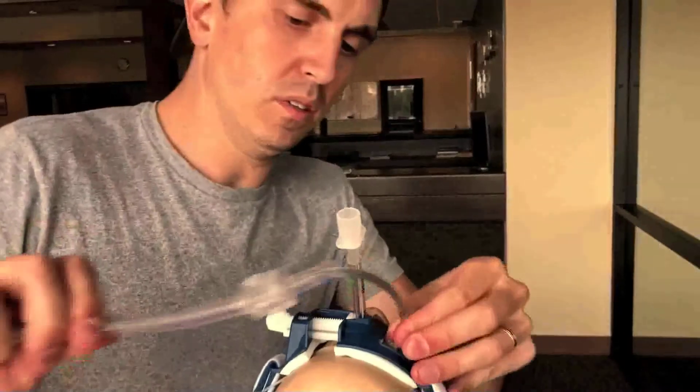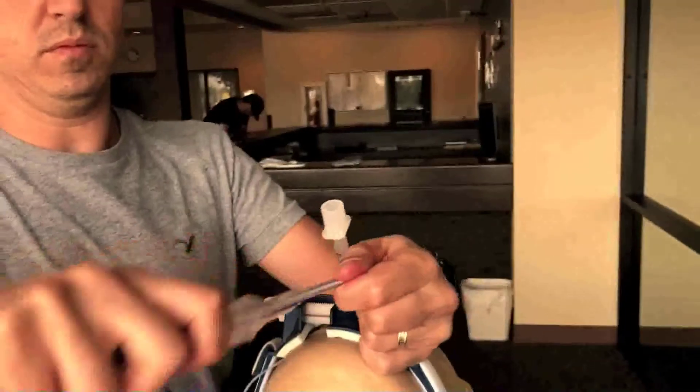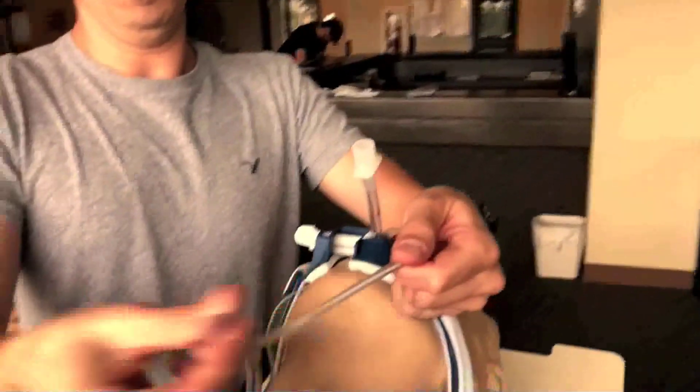We're going to slowly pull off the endotracheal tube while at the same time holding on to the gastric tube, again verifying that depth, and then we're going to tape the tube to the chin independent of the endotracheal tube.